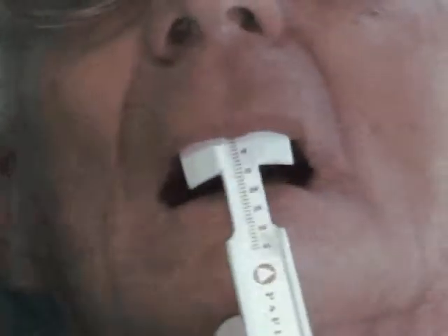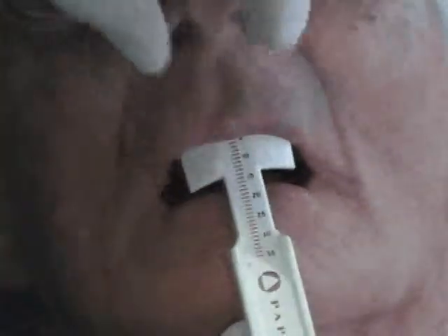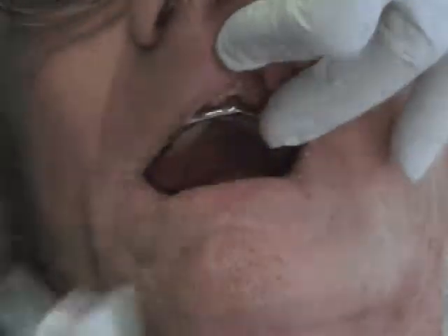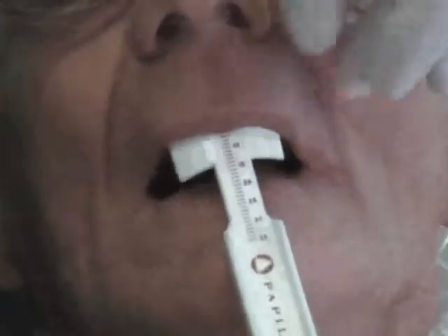And it looks like we got a 6. That lower lip line dead relaxed. We want that measurement in 6 millimeters. Right there. Okay, again, this thing fits right onto the bar. Deadpan drop the lip. It looks like a 6, 5.5 to 6.